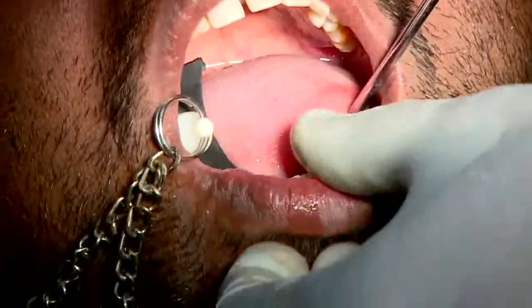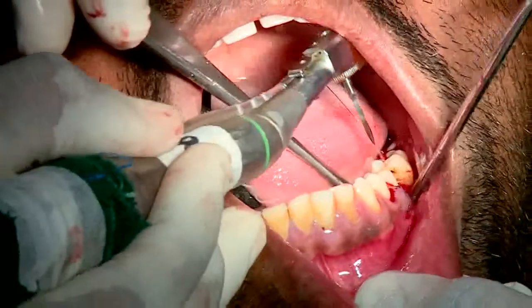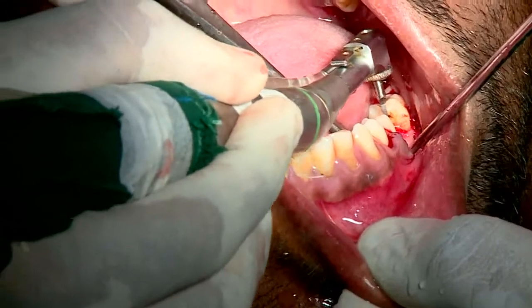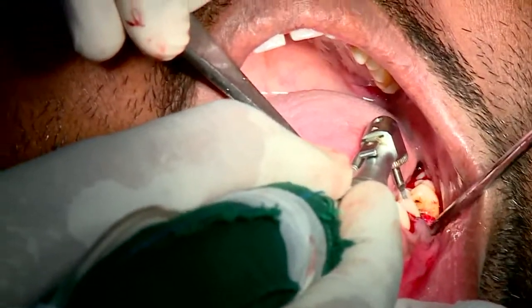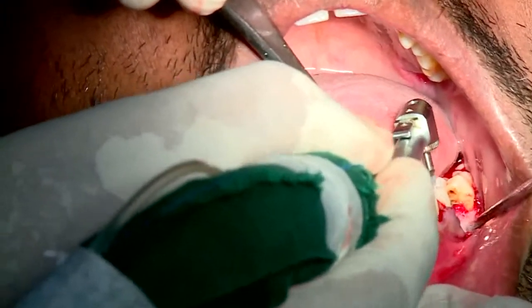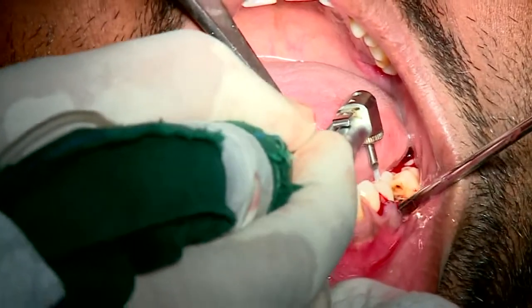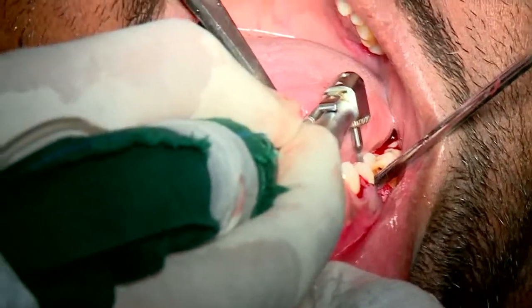Your first drill means a lot because we have to be parallel in all three planes. So my drill must not go towards the premolar or the molar. It has to be in a neutral zone. Here you can see that I am trying to place it along the bone.